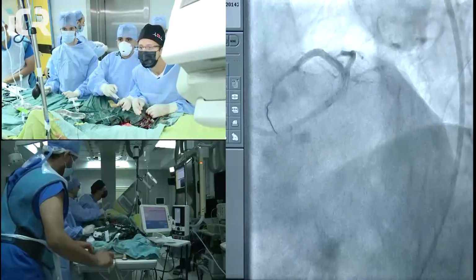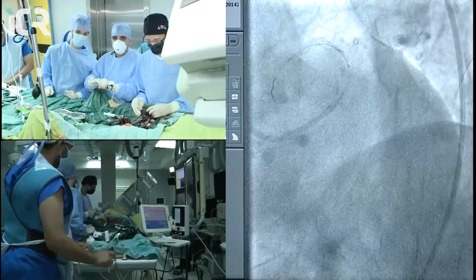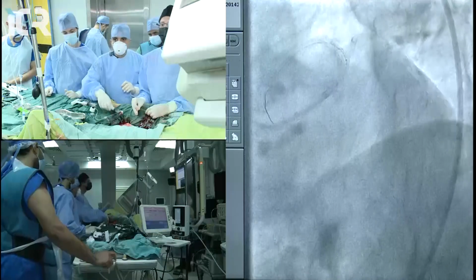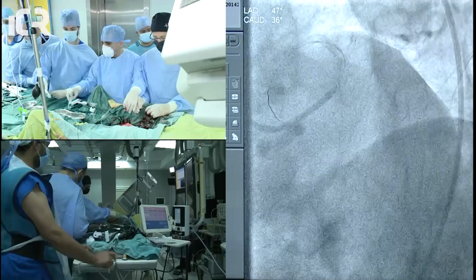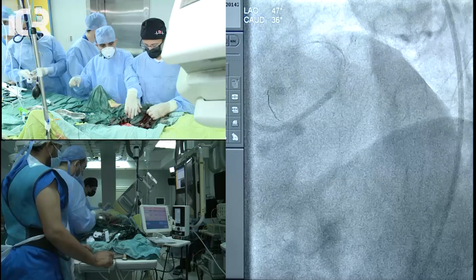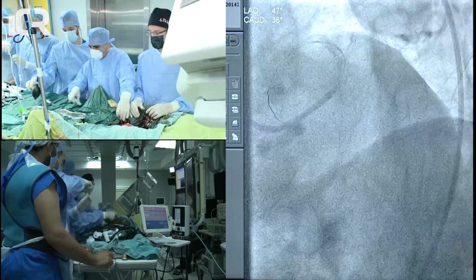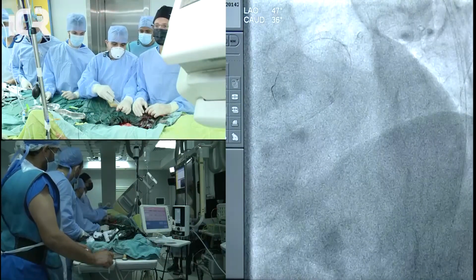I think that's okay. Need to go now at high pressure now, and then take a final shot here and in the cranial view. Okay. I need to get out to the balloon and to take good images. Nitro. Okay.